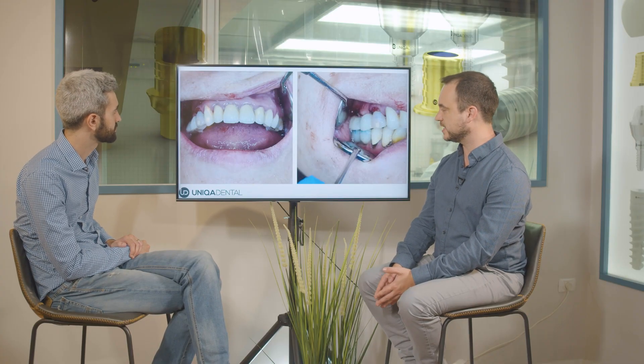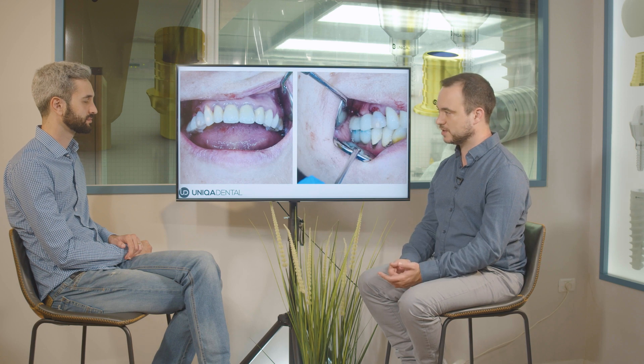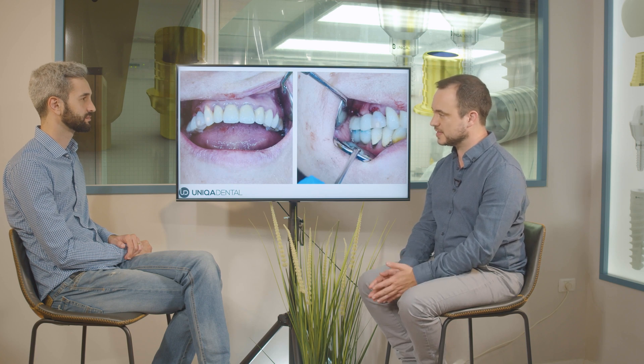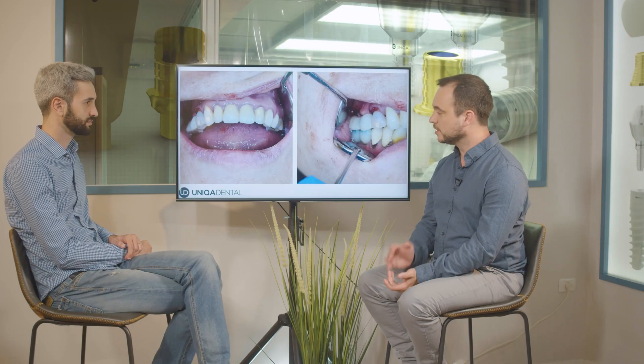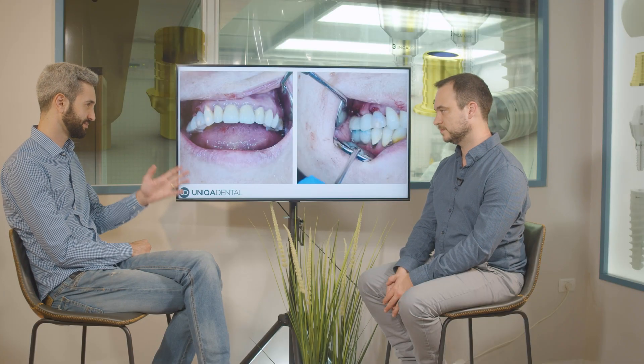We close the screw channels. As we said, the screw channel goes to the buccal side. In the future we'll change to an angular multi-unit, but right now it's very hard to place angled multi-units while you have an open flap, a lot of blood, and an inflamed area. You want to make it as easy as possible: put straight multi-units, make a temporary bridge, give it a few months to heal, mask the screw channel with a little composite, then take another impression and make the final bridge with the right angle and correct gingival height so the screw channel won't be visible. Planning, planning, planning.